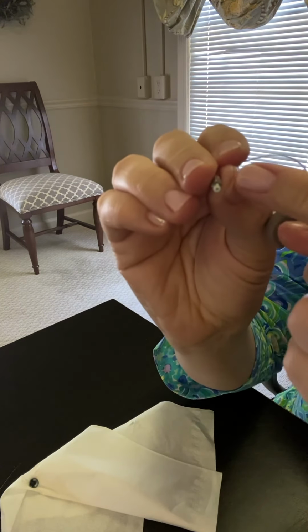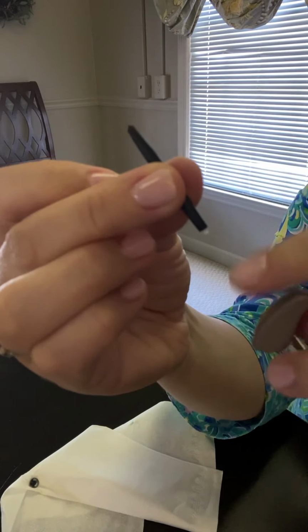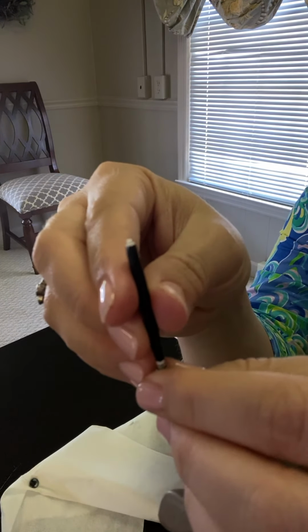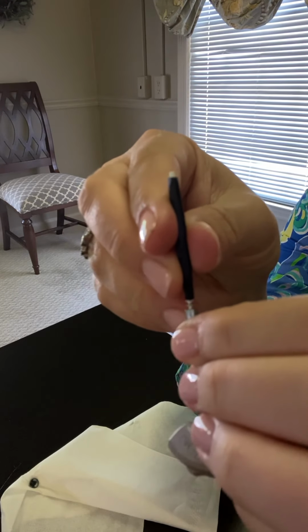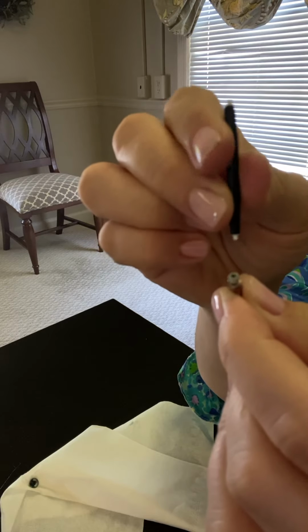The white piece in here is the filter. Your filters come in a pack like this, and each little stick is a new filter. So we'll grab a stick. The white piece is your replacement filter. The empty side is how you get the old one off. So take the empty side of the stick, go straight down and straight up. It grabs your old filter, leaves a hole.